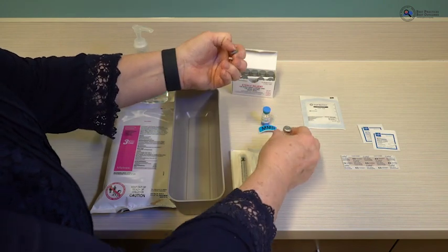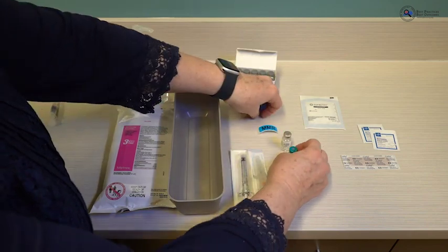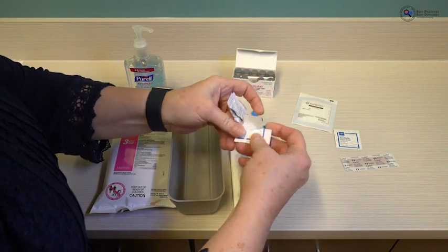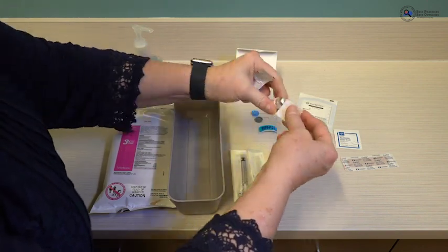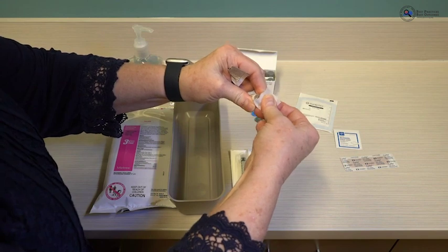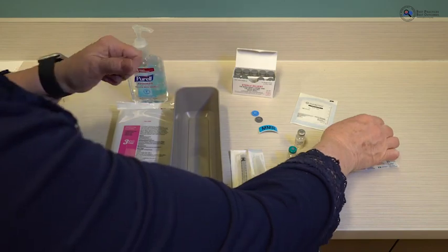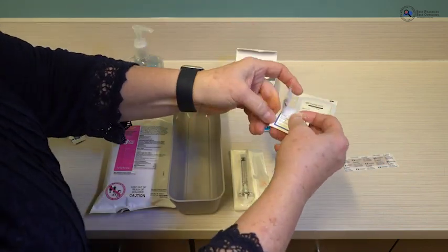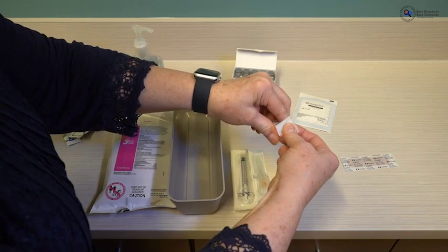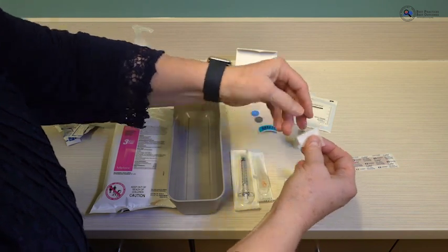Remove the caps from both the vaccine vial and the diluent, making sure your hands are clean. Have a sterile alcohol swab available and disinfect the top of the diluent using friction for about 15 to 20 seconds, then set it aside and let it dry. Do the same thing with a new alcohol swab for the vaccine — again, 15 to 20 seconds of mechanical friction — then set it aside and let it dry.